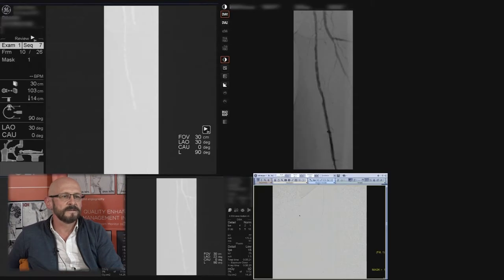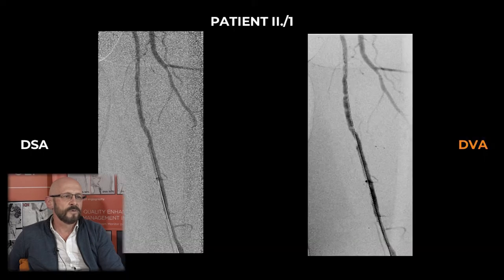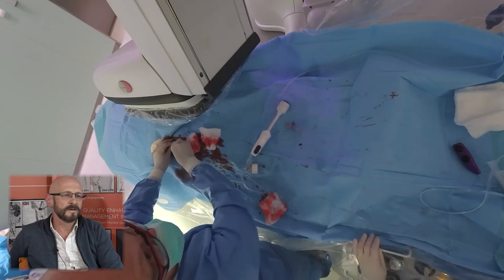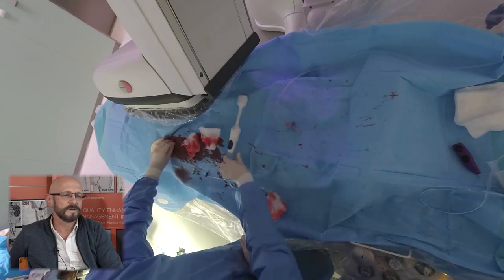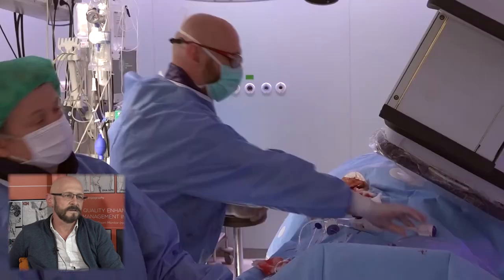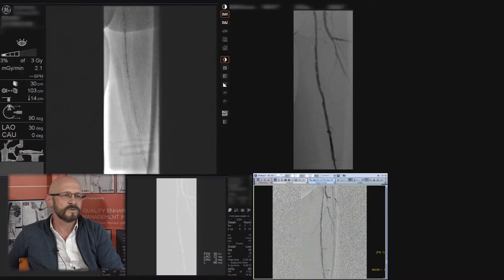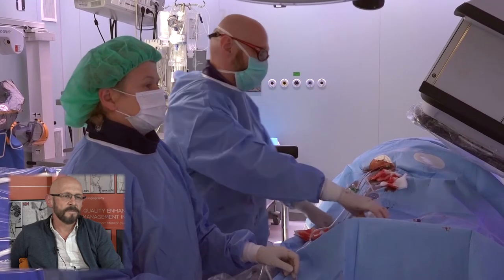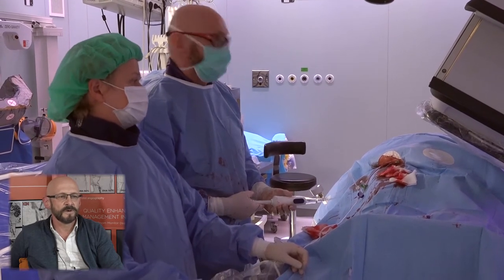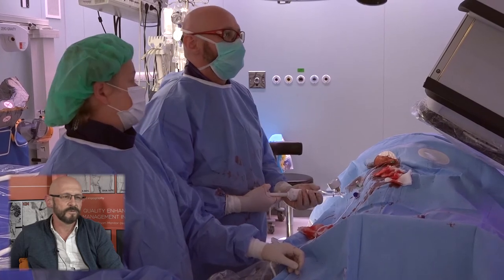One lesion was already dilated but as you can see there are more proximal calcified lesions and another distal lesion at the bottom of the screen. We didn't want to use a long balloon like 200mm or 240mm because I was afraid it would induce dissection at non-diseased areas. So we tried to focus only on the stenotic parts — unfortunately that requires more ballooning, more radiation — but maybe less chance for stenting, which I'm not a big fan of. I try to avoid stenting and use long ballooning up to three minutes.